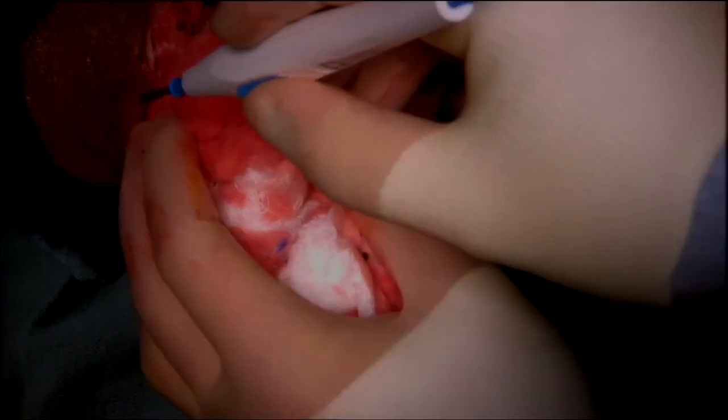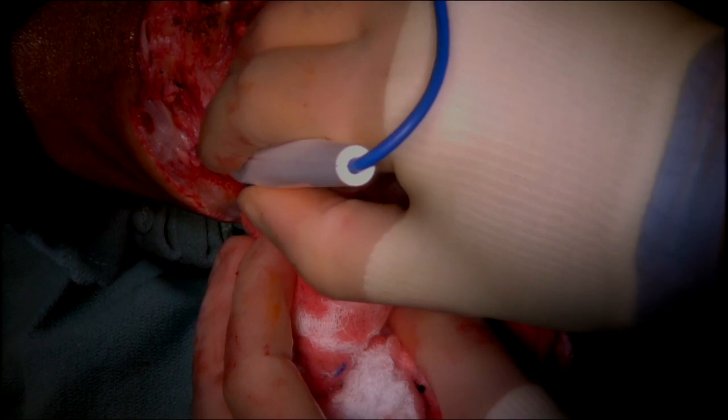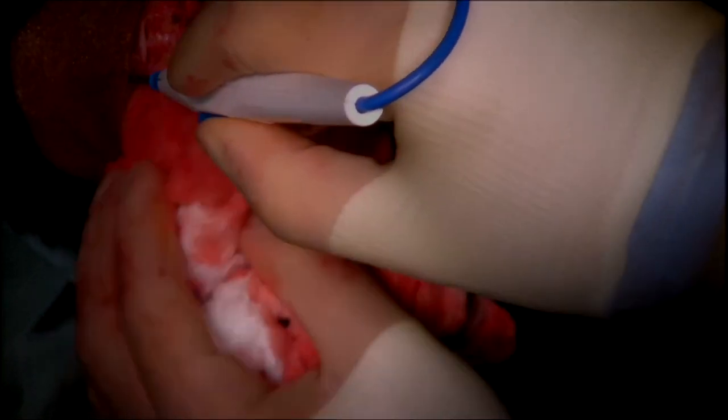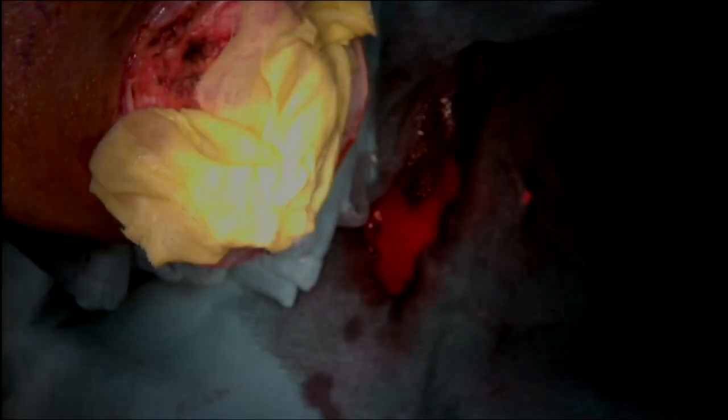Once all the exposed vessels are tied off, further hemostasis is achieved on the remainder of the wound using Bovie electrocautery. Xeroform sterile petroleum dressing is then applied to the wound, which is then wrapped with Kerlix sterile gauze.